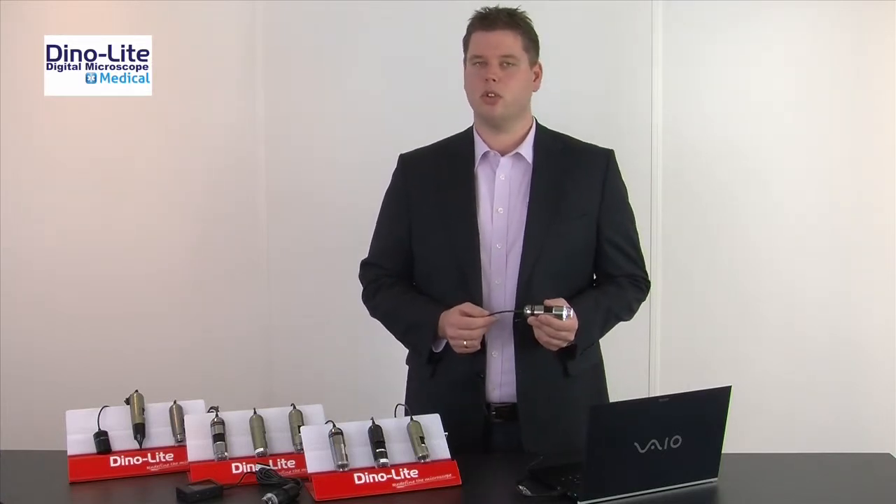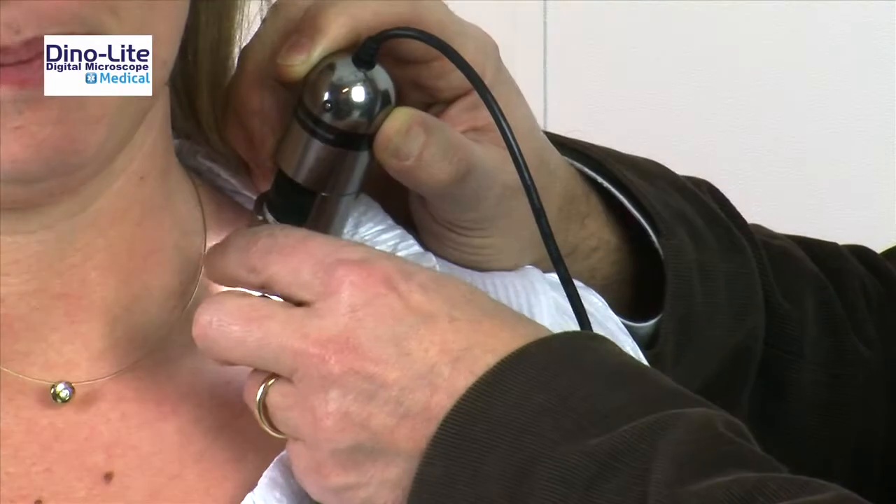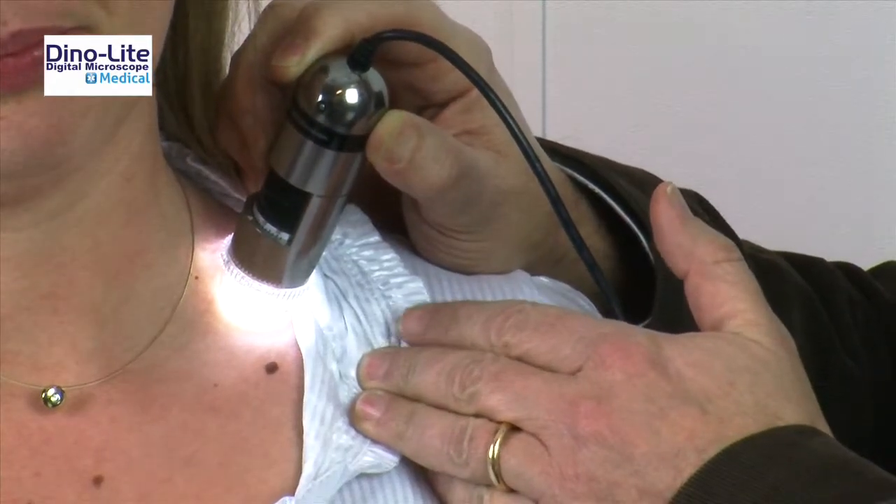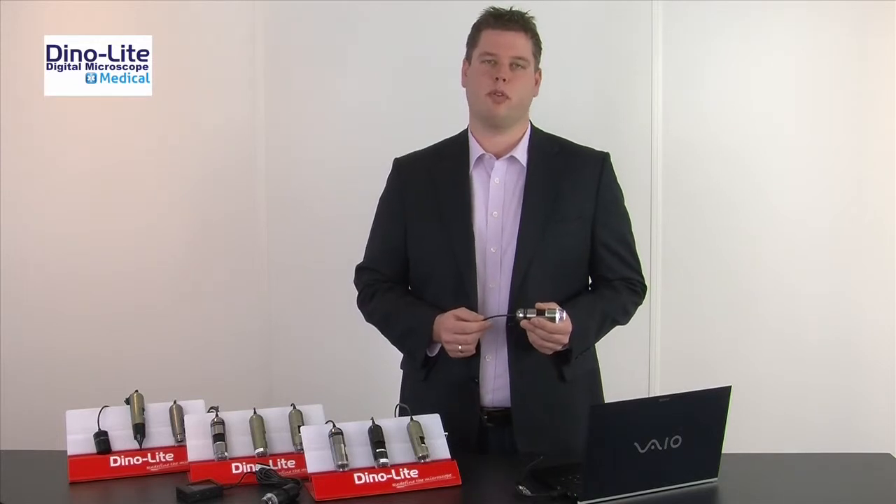It's a very convenient and easy to use tool for inspection of the human skin and scalp. It offers better and clearer images than any digital camera with macro function could provide.